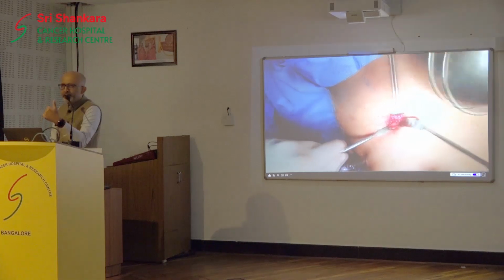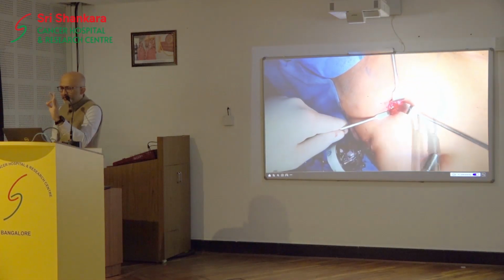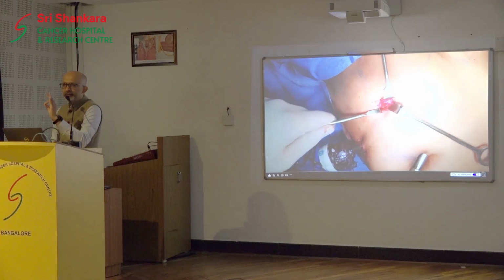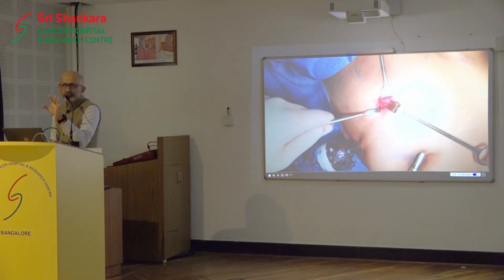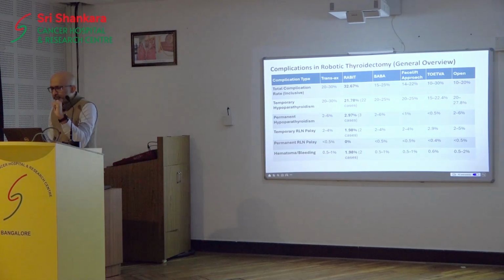We implant into our primary wound area. We implant it into that, and we place a clip, because here there are no other clips. So it's very easy to identify it for a future case. And you will never enter in this area, right? So that is that.